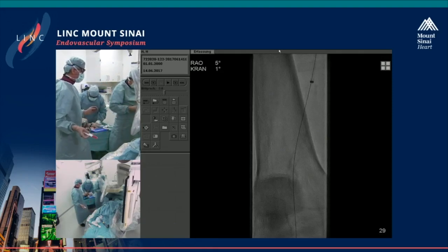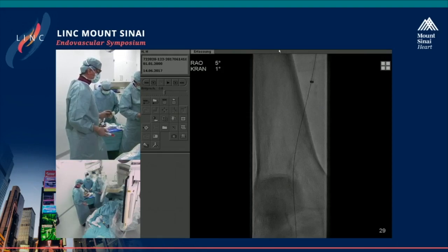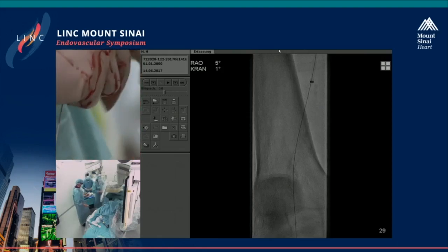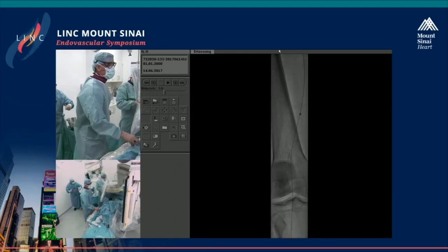Drug-coated balloons, maybe, yeah, for below the knee, not so much information. So therefore, our hope is that maybe this kind of device will help us here to have better patency in this area. We are here having a little problem that we have still one more talk to do.